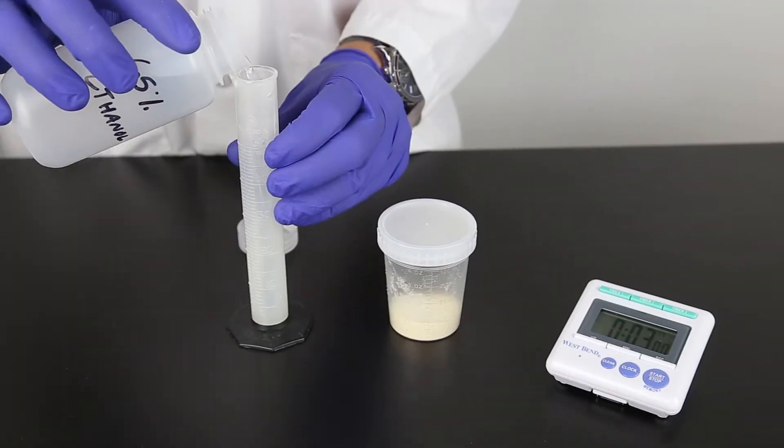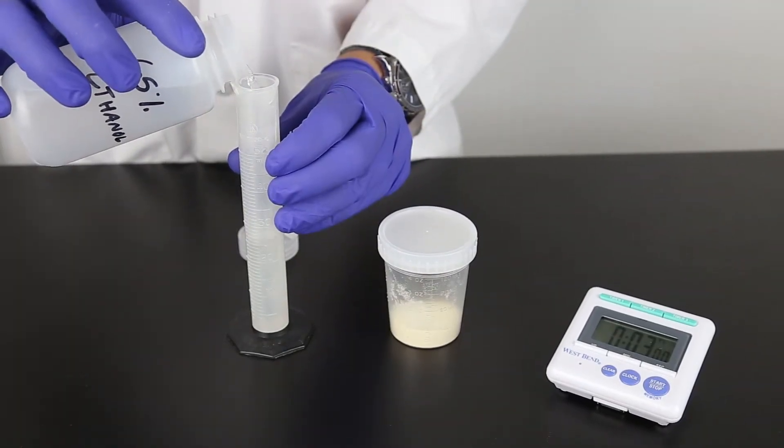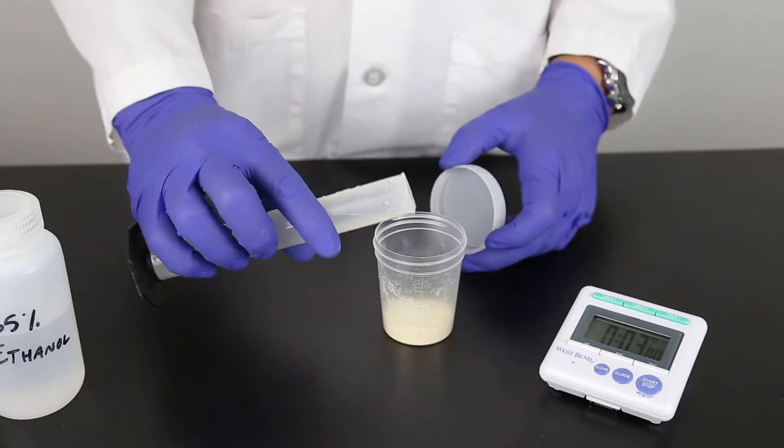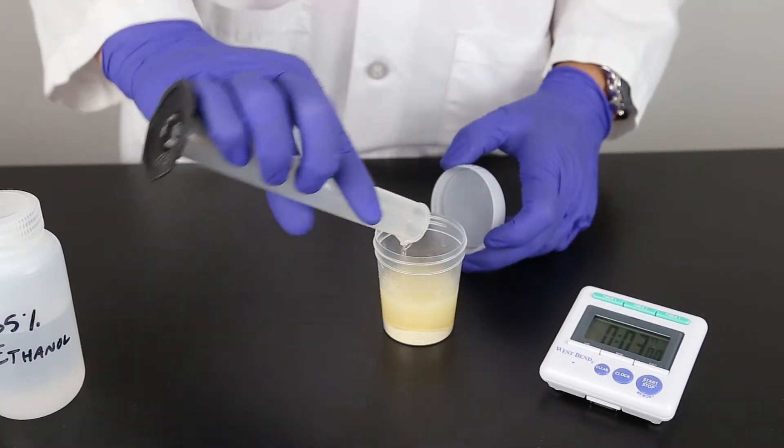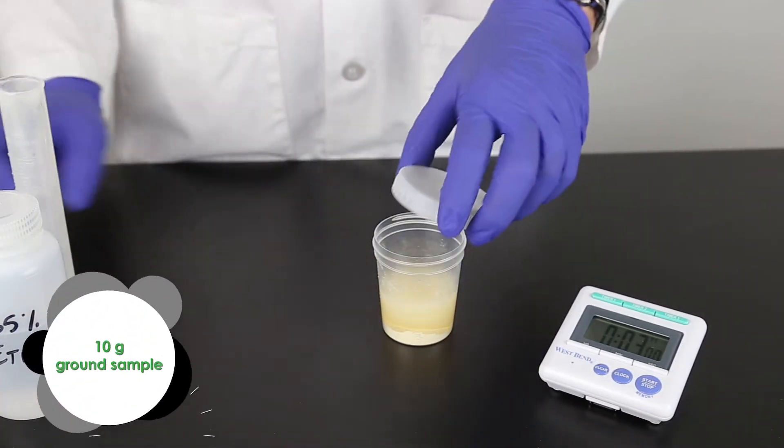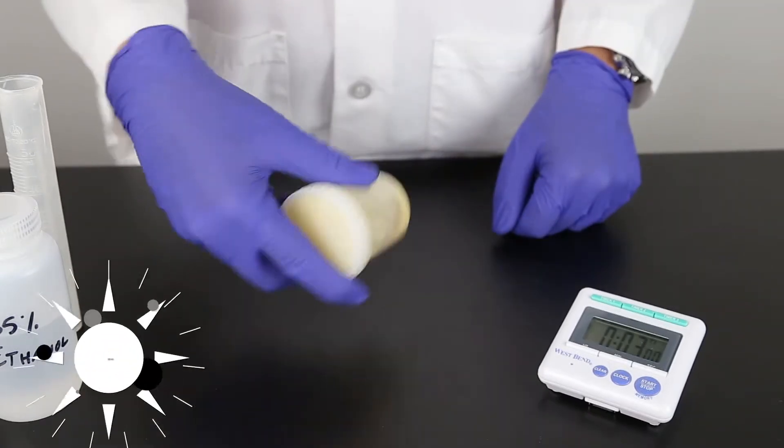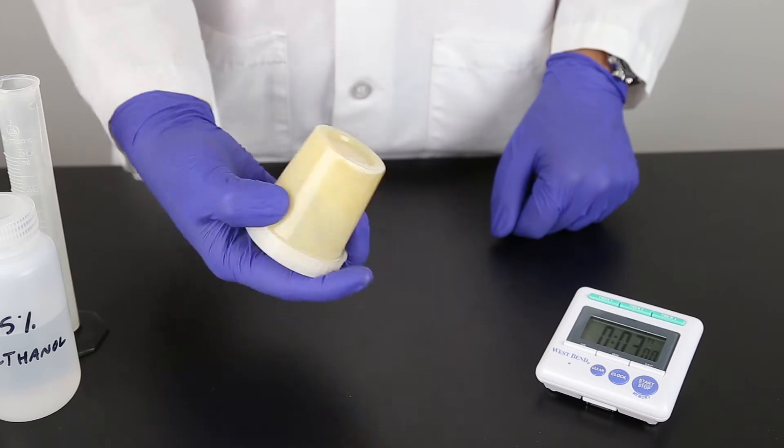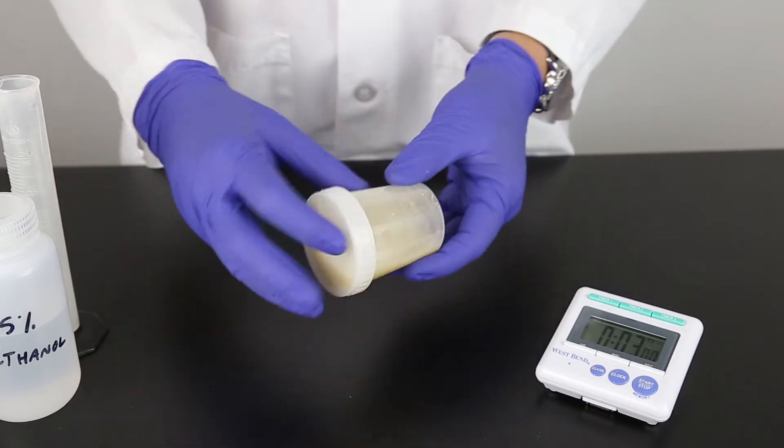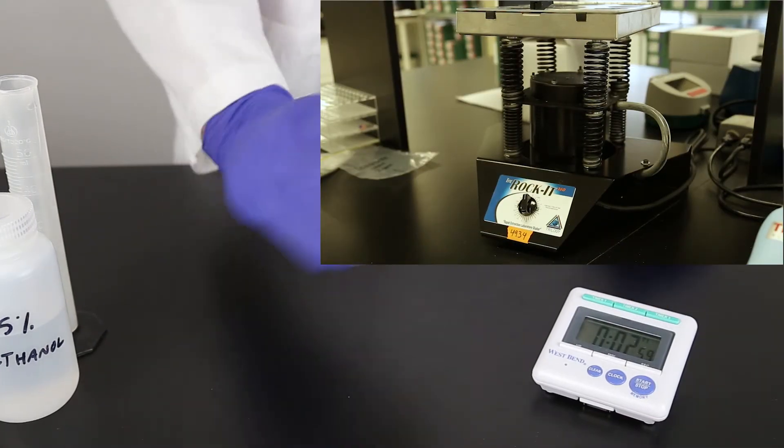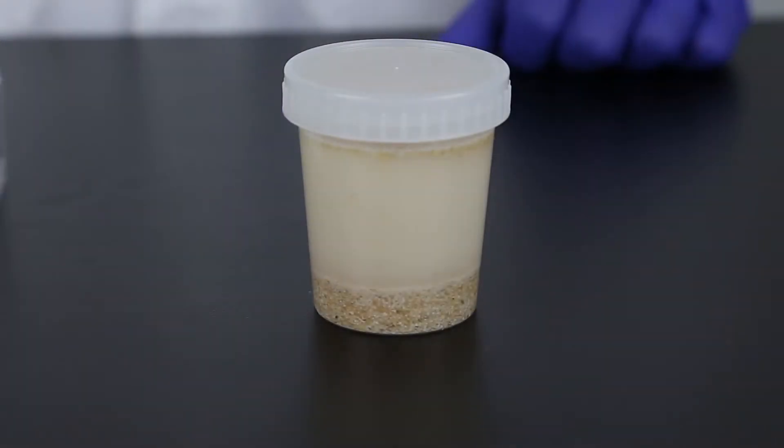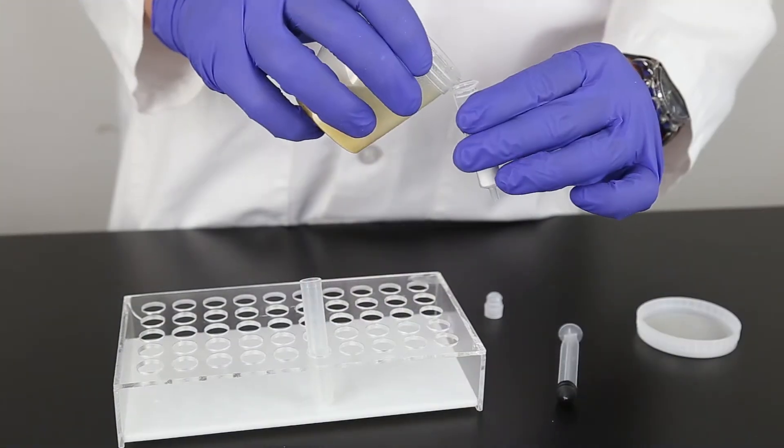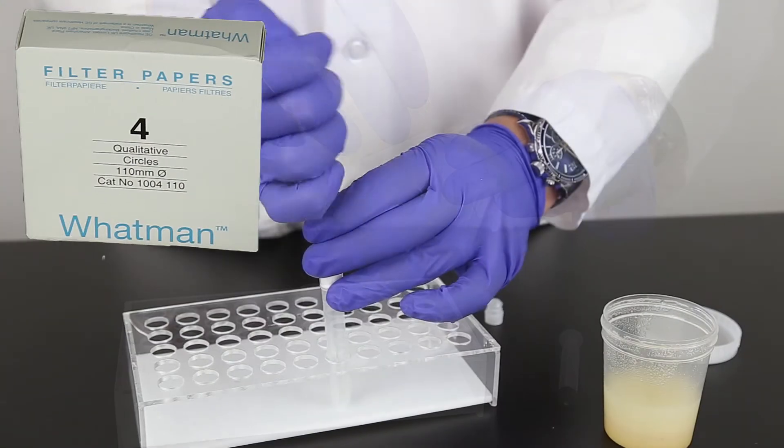The sample is extracted with a ratio of one part sample to five parts 65% ethanol. For this example, we're using 10 grams of ground sample with 50 milliliters of 65% ethanol. Vigorously shake for three minutes using hand or mechanical means. Allow sample to settle and filter with a filter syringe or Whatman No. 4 filter paper.